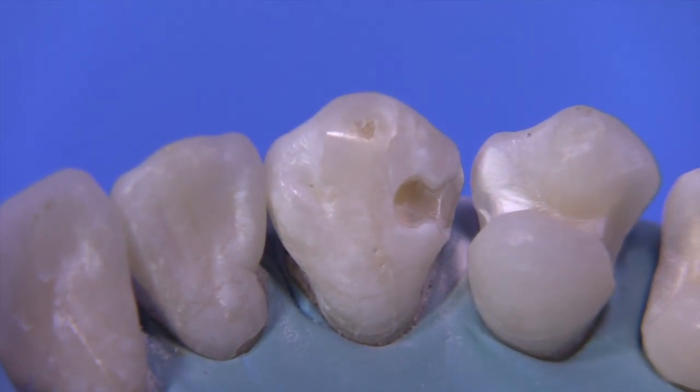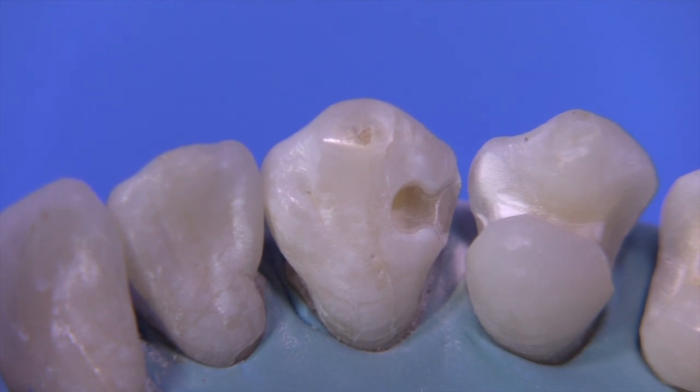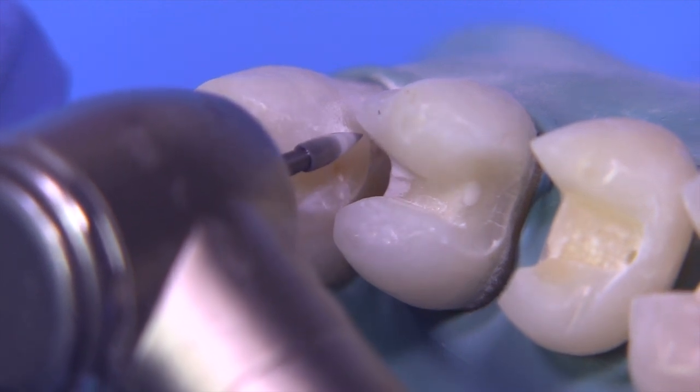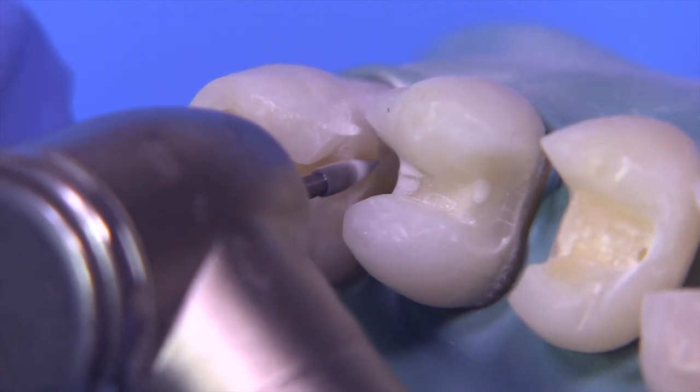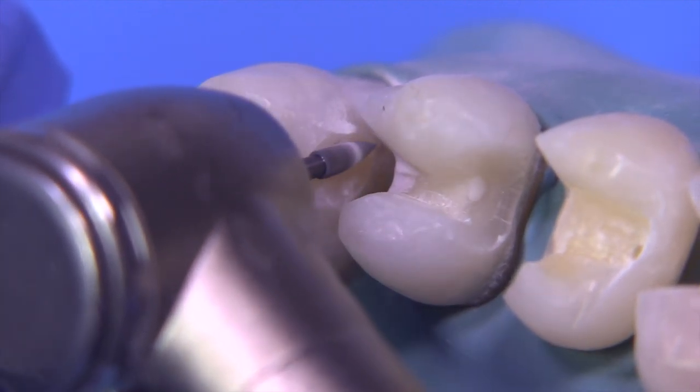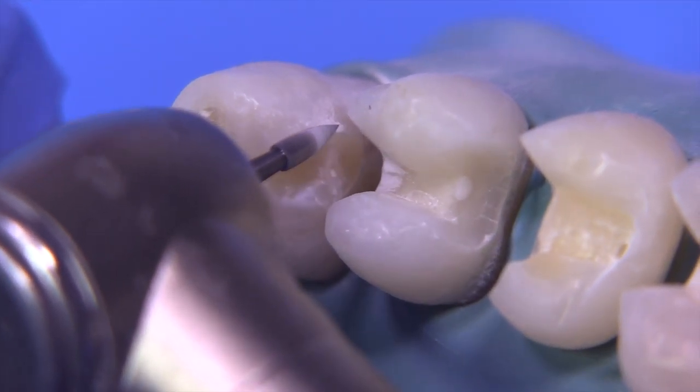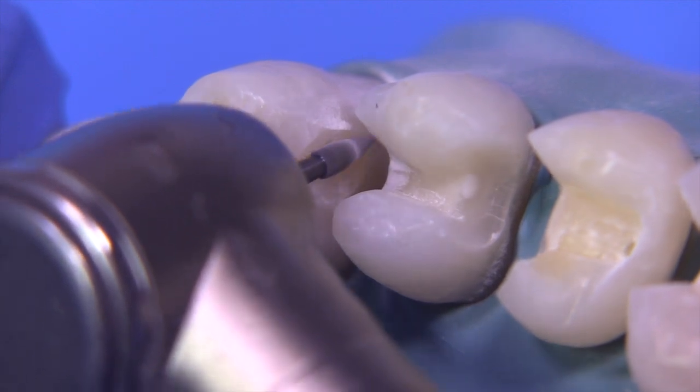Now that we have a little bit of a hollow grind started, we can continue getting a little bit more of that completed, getting some of the finish lines done out near the facial, the gingival, and the lingual. But we really can't rely on this burr to give us the bulk that we need for the casting to be made very accurately.